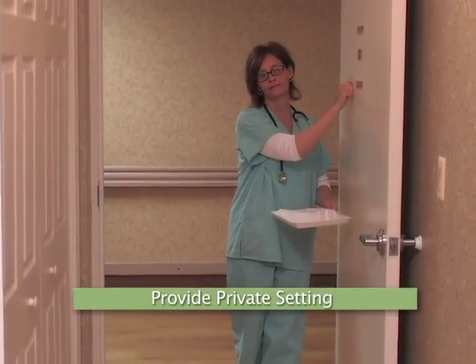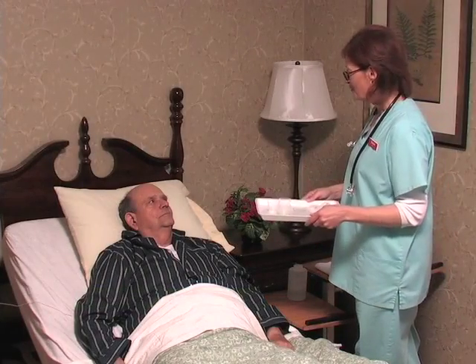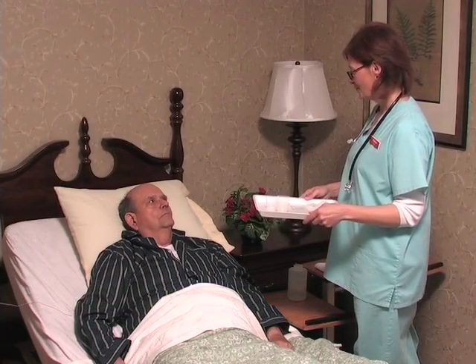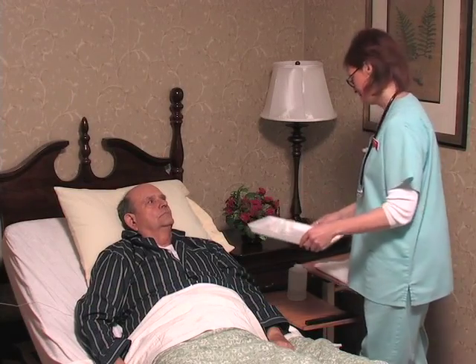Hi, Jerry. I'm back with your medications. Do you have any questions before we begin? Nope, everything's okay. Okay, I'm going to make sure your tube is in place.